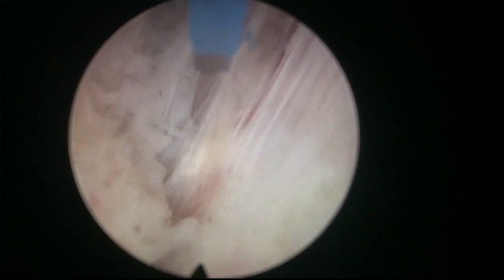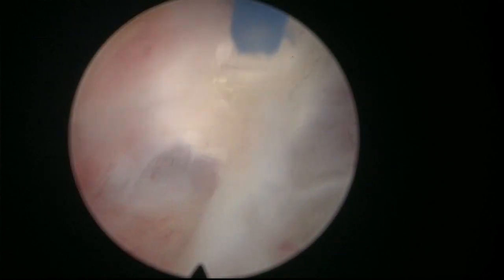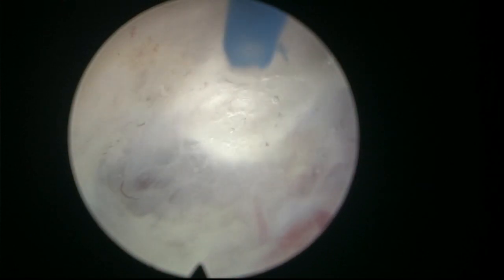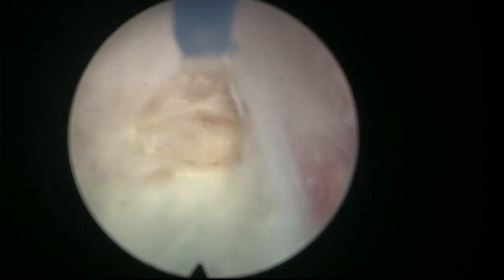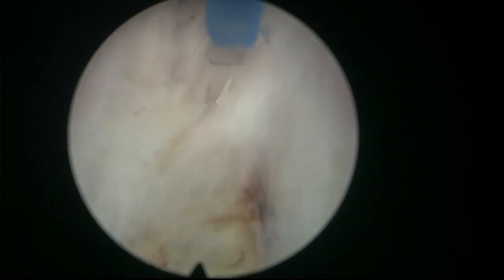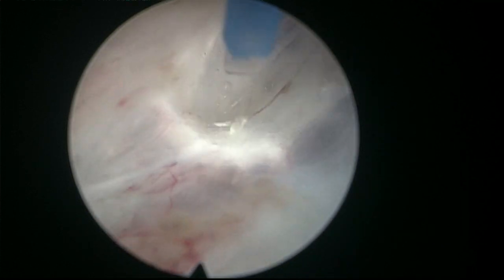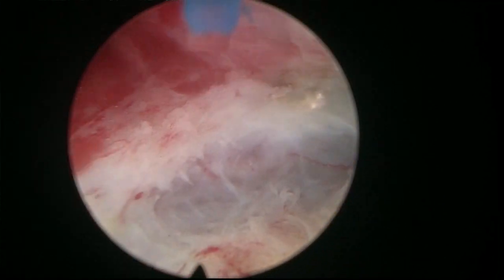So just being a little bit careful with the hemostasis, usually you can progress reasonably fast. Also, you can see that I'm not lifting my foot from the pedal. I am dissecting continuously all the time, with just very brief stops when I have to check something. But that makes this operation extremely fast. You see, I'm just progressing, stopping to coagulate. Not too much, not too little. Just enough.